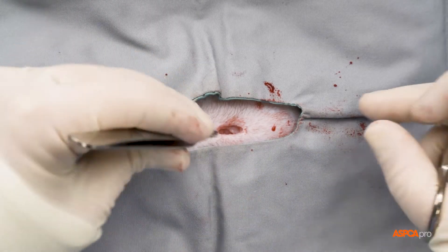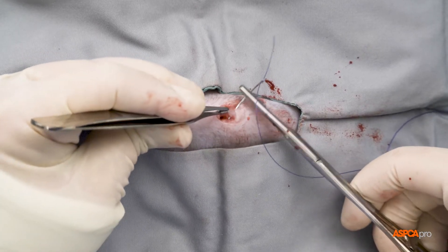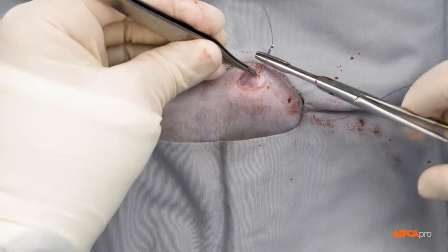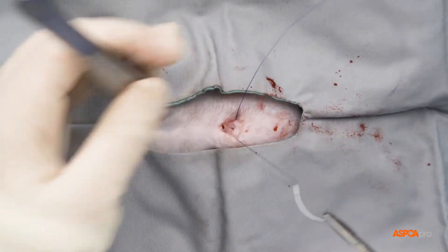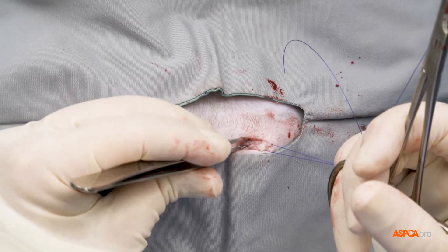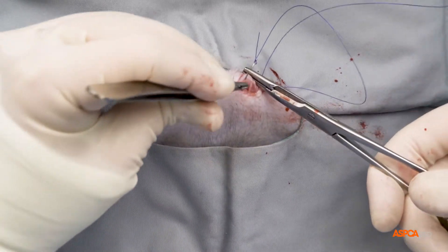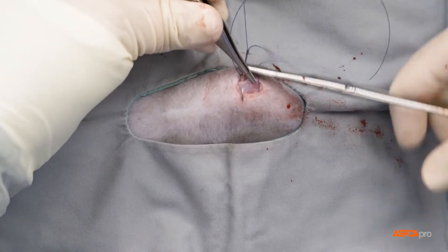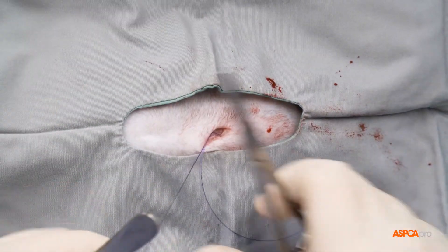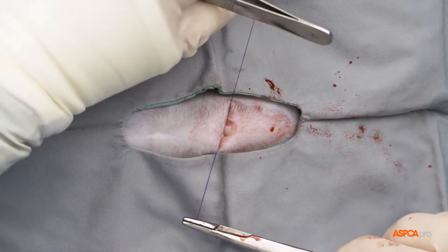Next, the muscle layer of the abdomen is closed with a special type of criss-crossing pattern called a cruciate pattern. Incisions less than 2 centimeters will typically need only one of these sutures, but a larger incision will require more. It is secured using square knots.